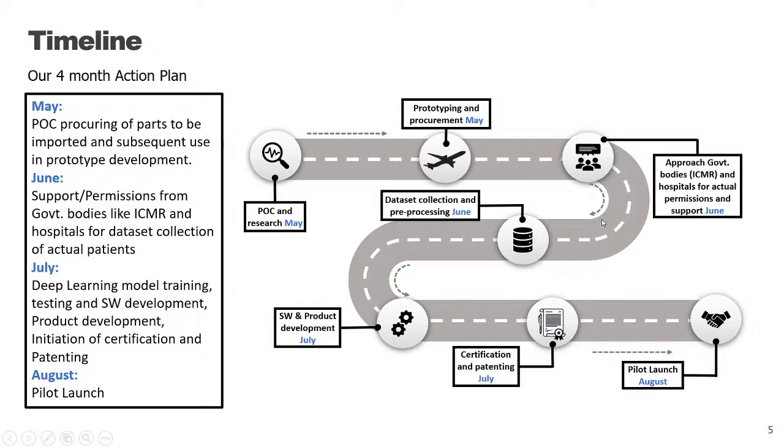we have also talked to some foreign open bodies, like Healthcare Engineering, helpful engineering. These bodies promote COVID-19 open source devices and projects that can actually help curb and control this pandemic.